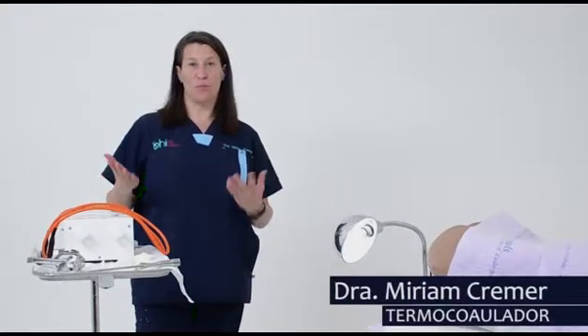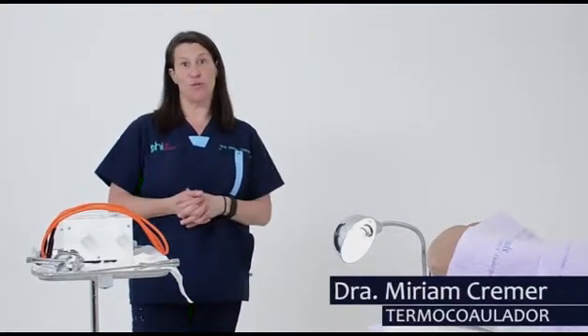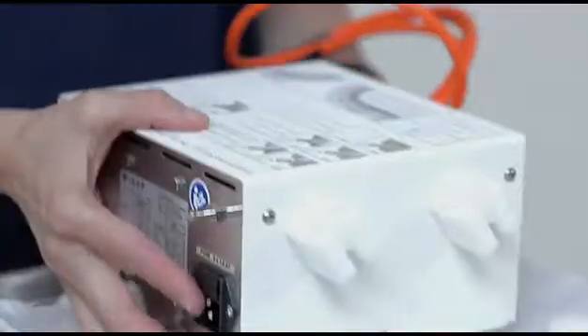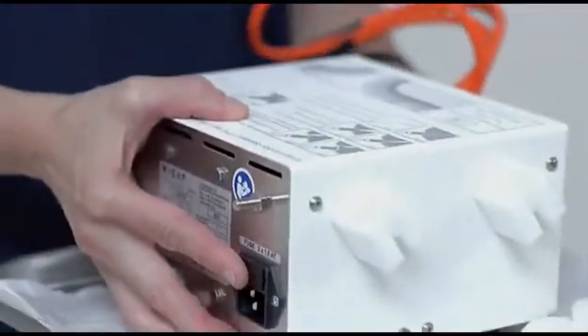Hi, my name is Dr. Miriam Kramer. I'm really excited to show you the use of the thermocoagulator. This machine is really handy — as you can see, it's really portable, and you can take it anywhere to do your treatment.